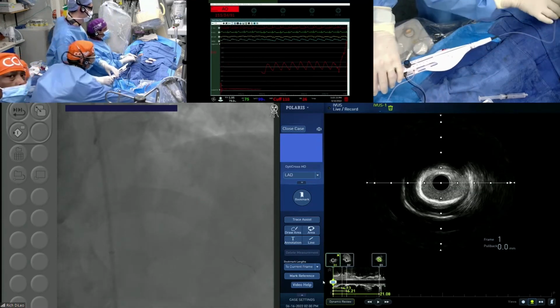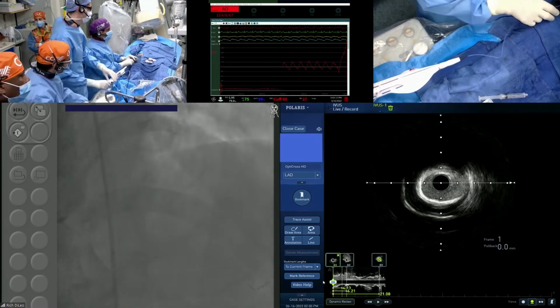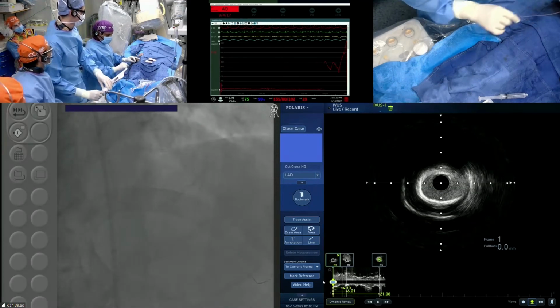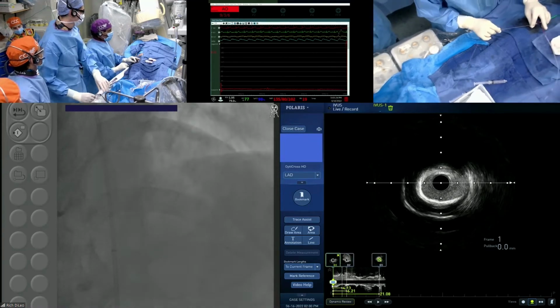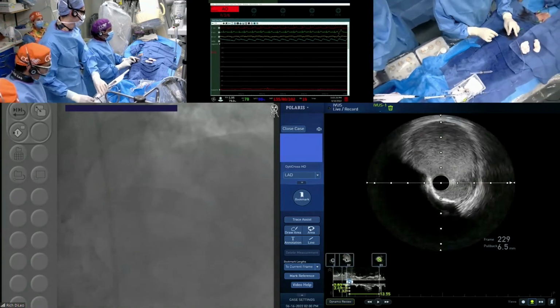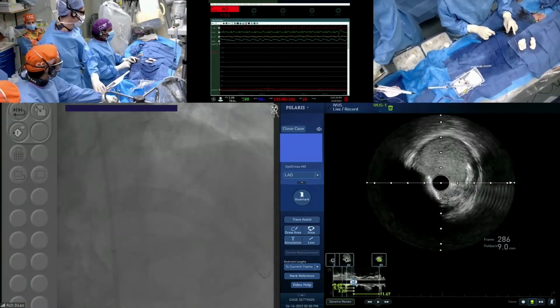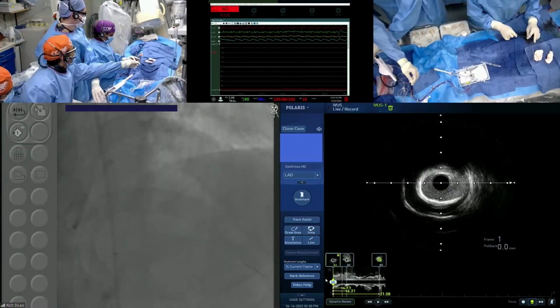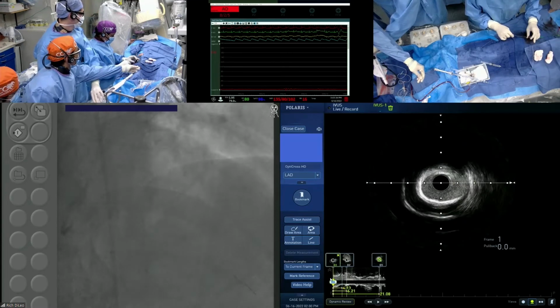Yeah, no question about it. But indeed, the aneurysm seemed to be a little eccentric, to say the least. I don't know if it's pseudo or circular-like, but definitely an eccentric aneurysm. Run-through, one can say, in that location. It's a real aneurysm, not a pseudo-aneurysm, because you can see the three-wall structure.